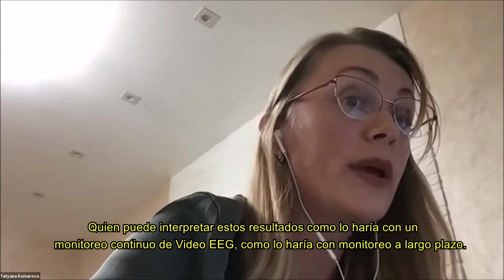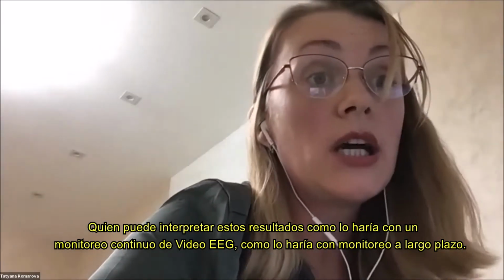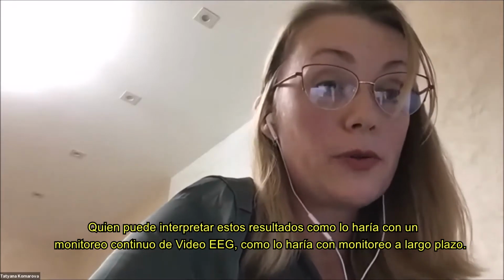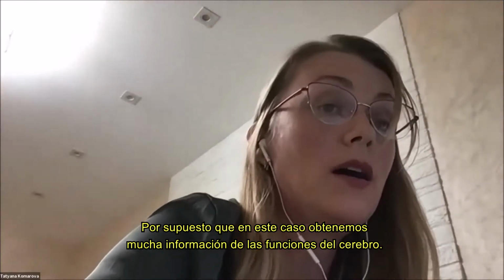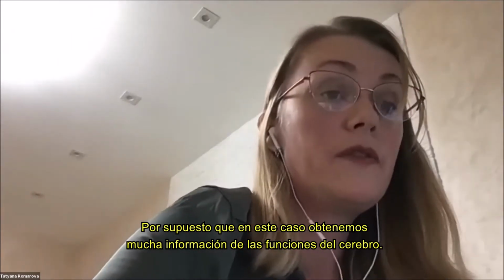Of course, in this case, we get a lot of information about brain function.